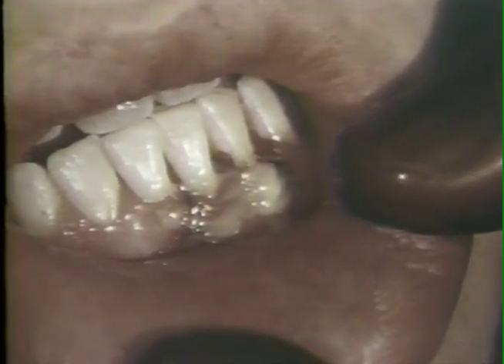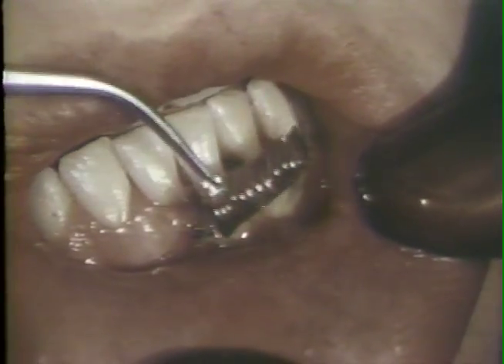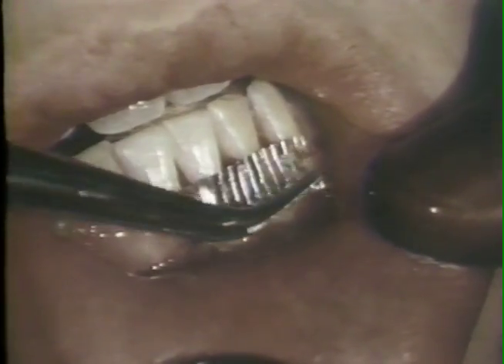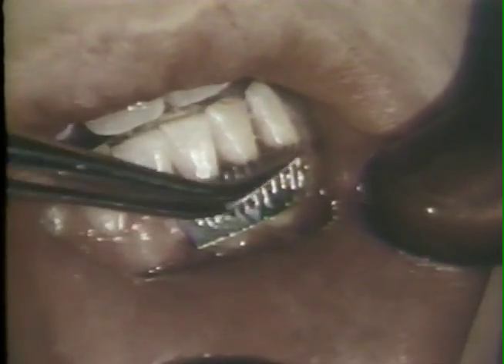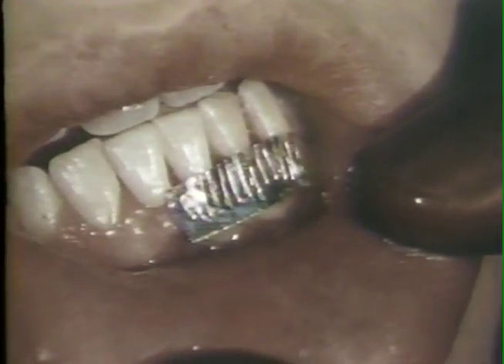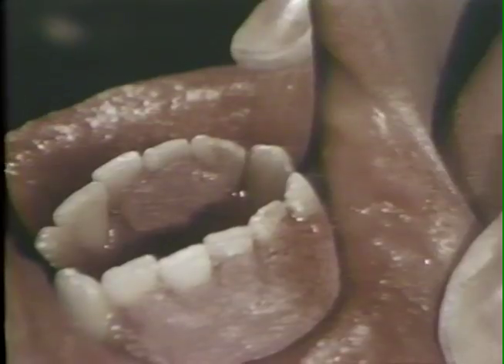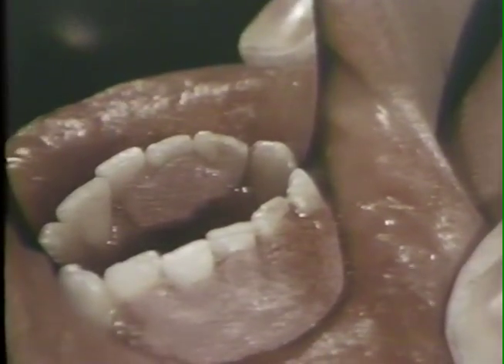Acromycin ointment is spread over the flaps and the sutures. Tin foil is adapted to the wound area and to the adjacent teeth. Surgical dressing is placed on top of the tin foil and locked in between the teeth with a plastic instrument. The surface of the dressing is trimmed with the lip to assure full freedom of lip movements. A small piece of lingual dressing has been placed to provide full coverage of the sutures and to help hold the labial dressing in place.